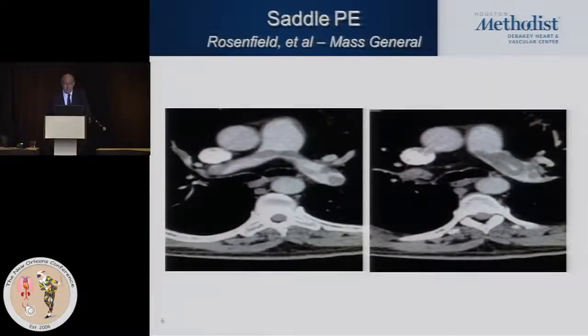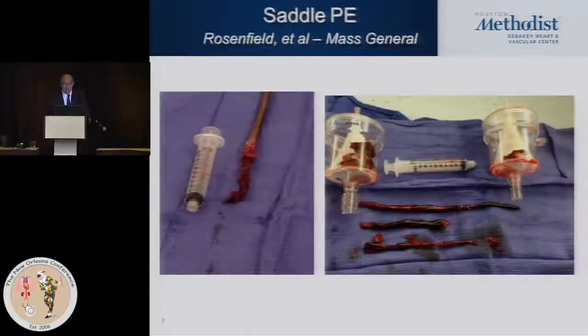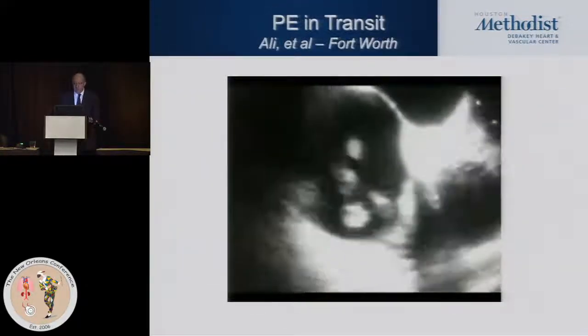And a saddle pulmonary embolism was also treated the following year at the Mass General using this technique. And I don't think this is a particularly good device for PE yet, which I think will happen. But it's ironic, as I mentioned earlier, because that was the driving force for the development of the device. And we'll talk about why it has limitations for that. Nevertheless, it has been used successfully in some instances for the removal of pulmonary embolism.